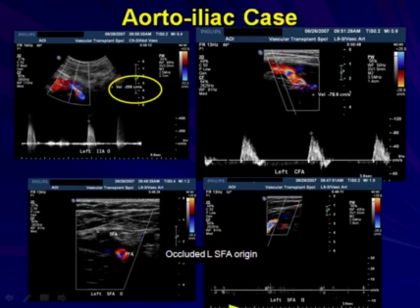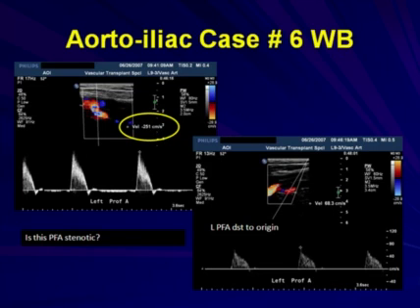When we got down to the level of the femoral, we noticed that the left SFA is occluded and confirmed that with spectral Doppler. And here is a left profunda adjacent to that that's 251 centimeters per second. Here's the PFA distal to the origin.